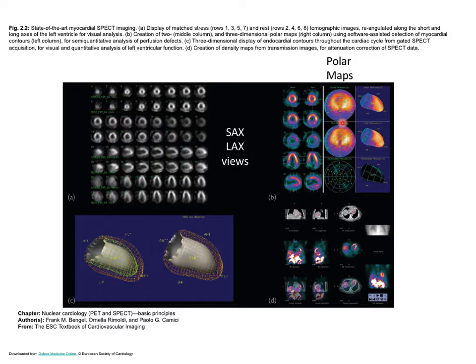It's shaped like a bullseye. And the orientation is the classic cardiology orientation, where you're looking at the patient's heart from the apex towards the base, i.e. from the patient's feet towards their head, right? So that the septum, or the right side of the heart, is over here on the left side of this map, okay? Because we're looking from the feet to the head.